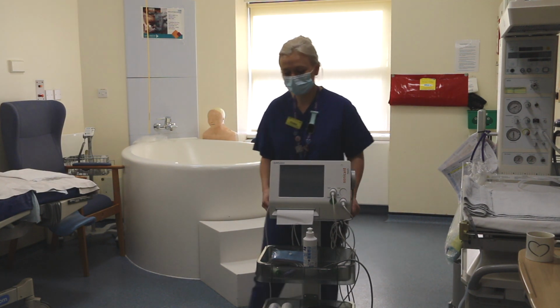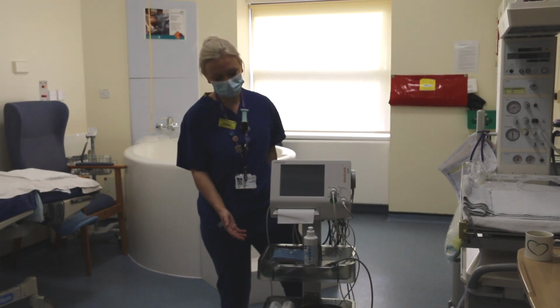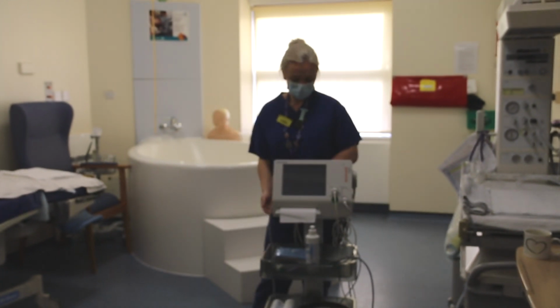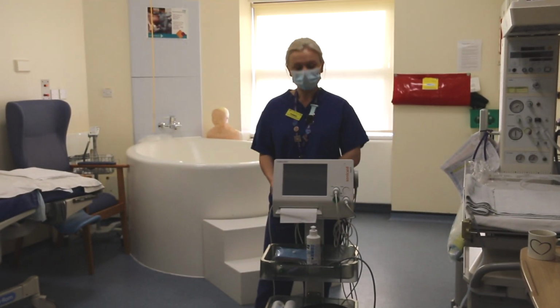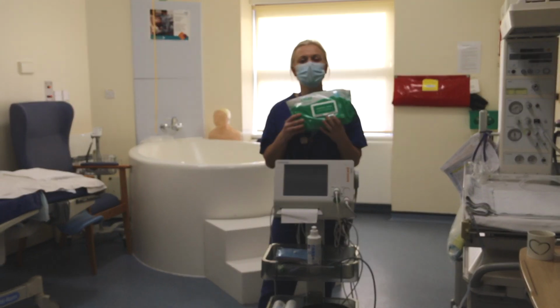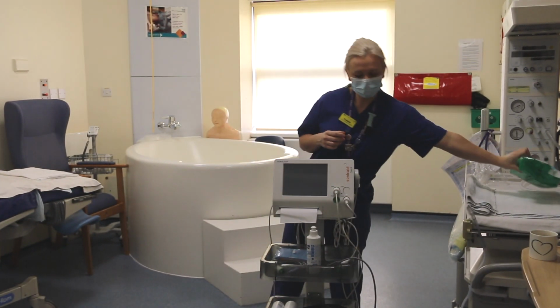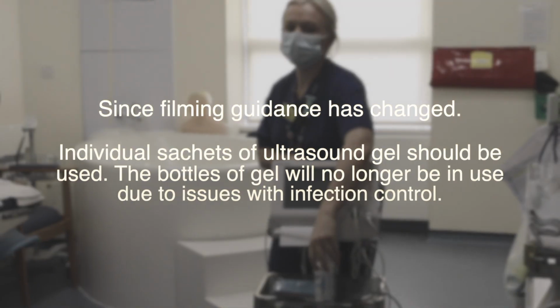It's important that you visually inspect the CTG machine to check that it's clean and that there's no obvious issues with it that would make it unsafe to use. We should be cleaning the CTG machines using our standard Clinell wipes before and after use. And when using them, it's important that we use ultrasound gel.